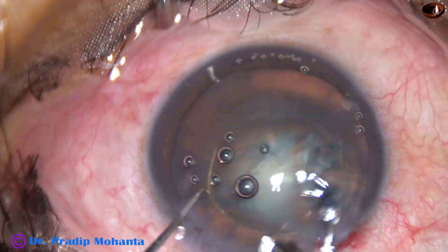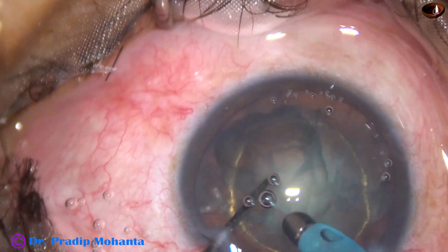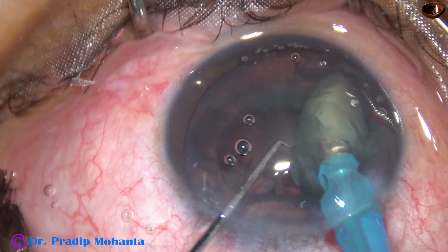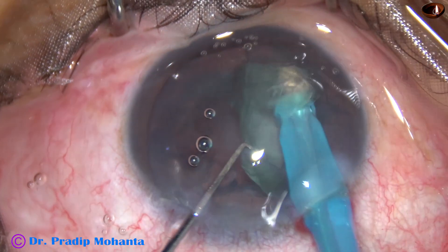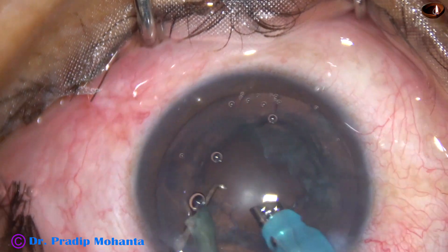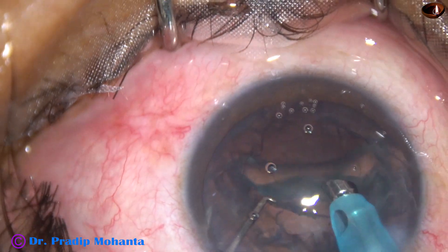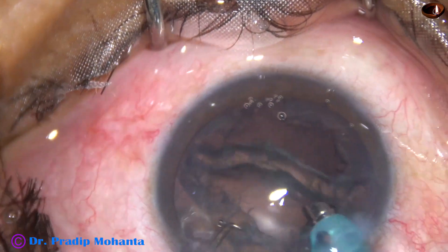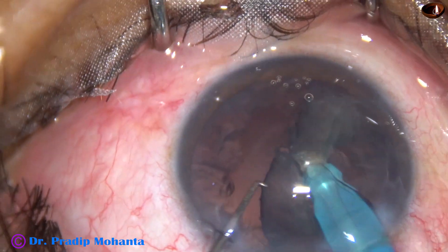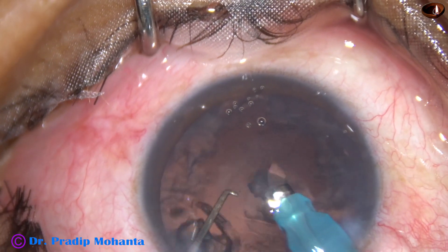Go into the anterior chamber with bevel down, aspirate some cortex, and then just pick off the nucleus and start emulsifying it. The whole thing gets emulsified in a very short time. So if the nucleus is small and the cataract is soft, we need not divide the nucleus into fragments. We can just emulsify, as shown in this case, after hydro delineation.